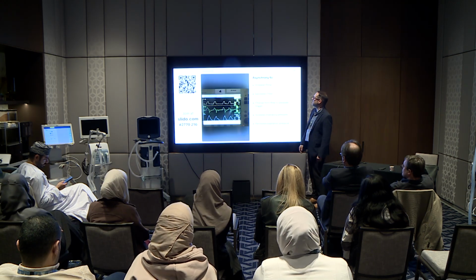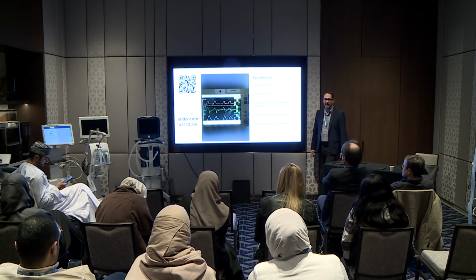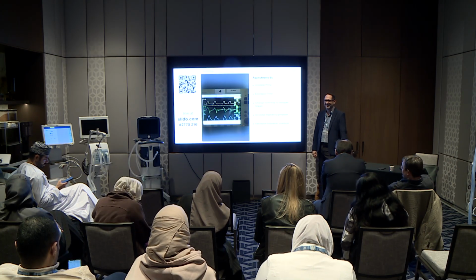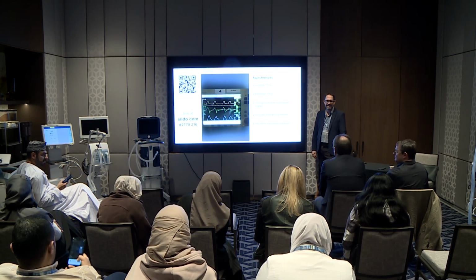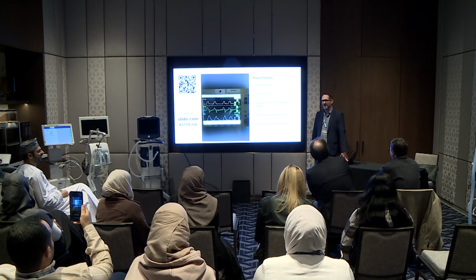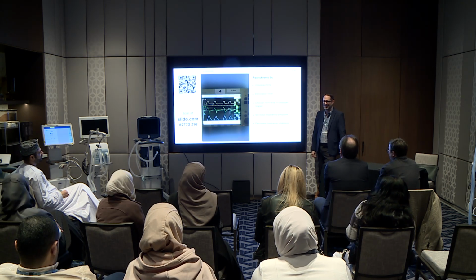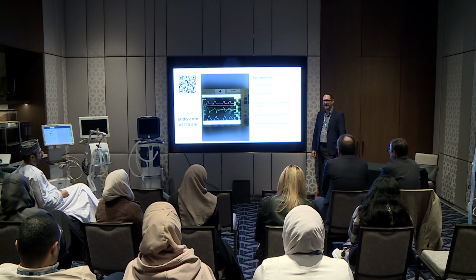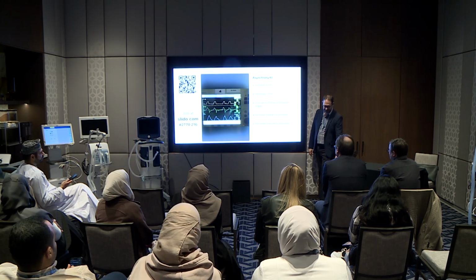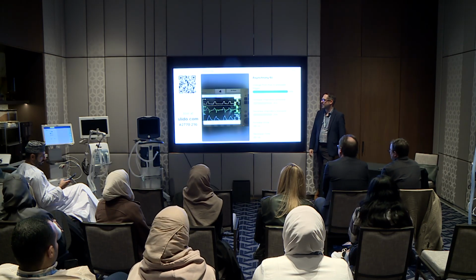So how would I fix this? I'm not going to take the patient's heart out. That would be horribly barbaric. Give a beta blocker. Yeah, we'd probably manipulate their heart in some way. What do we think the best response would be? The easiest one, without drugs. Just a slight manipulation of the ventilator. Change from flow to pressure trigger is the correct answer.